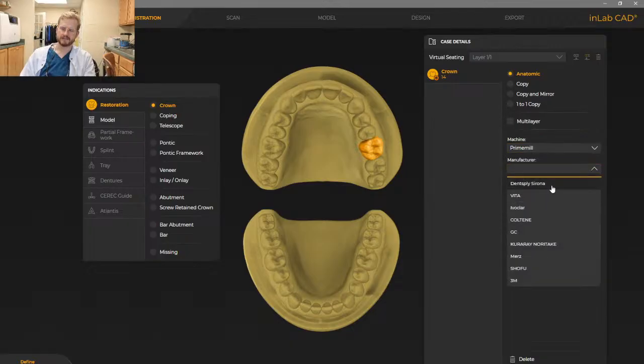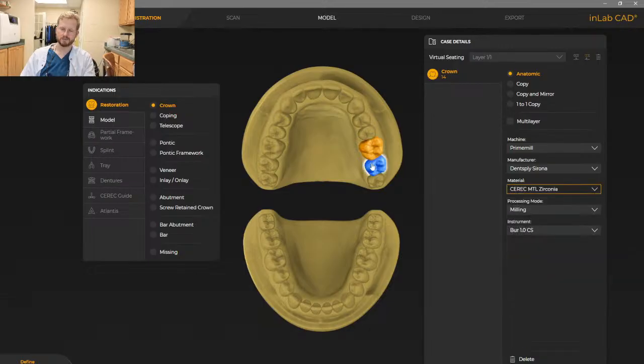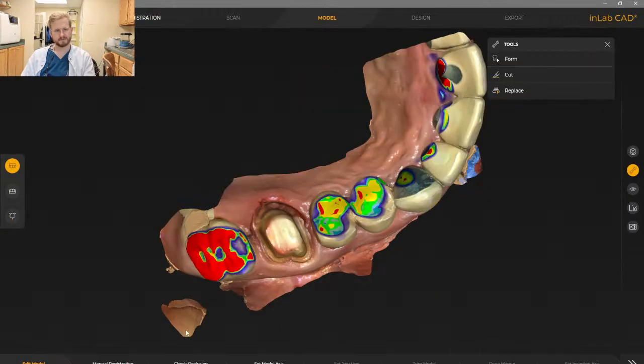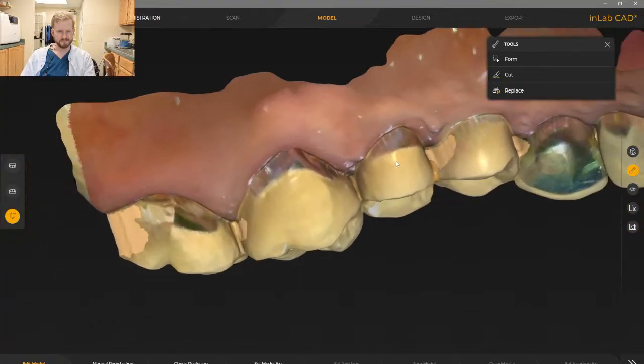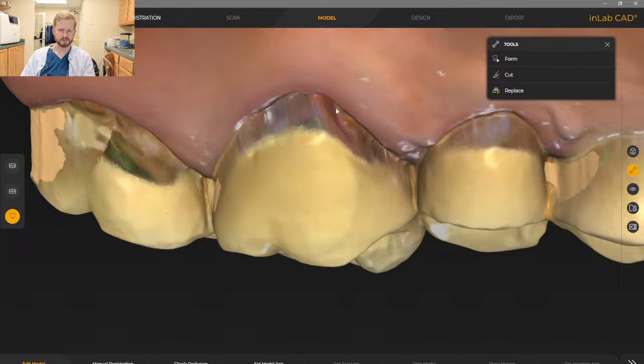The reason we did this today was the patient had an existing crown with recurrent decay under the lingual margin. I will show you the pre-op scan in just a moment. It looks like this. So we could see tooth number 14. There's already a crown there. It's going to be tough to see on the scan, but imagine feeling this with your Explorer along the margin. You're going to sink into a hole and it's soft and sticky, and that's just generally a bad situation if we want to keep the tooth for the rest of our life.